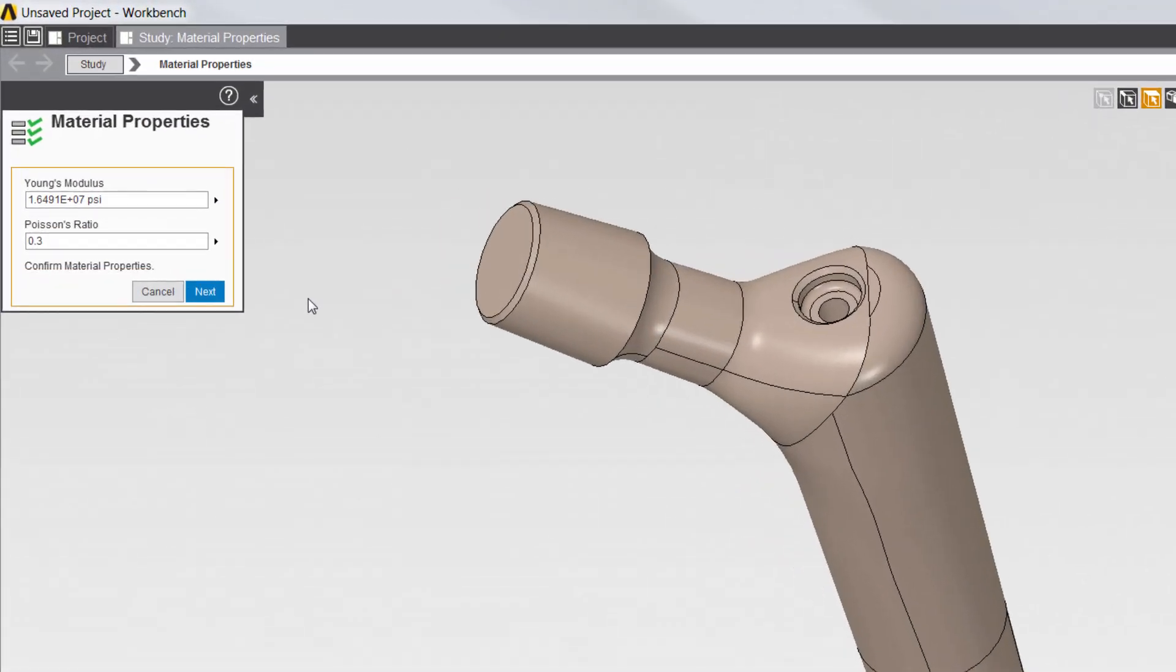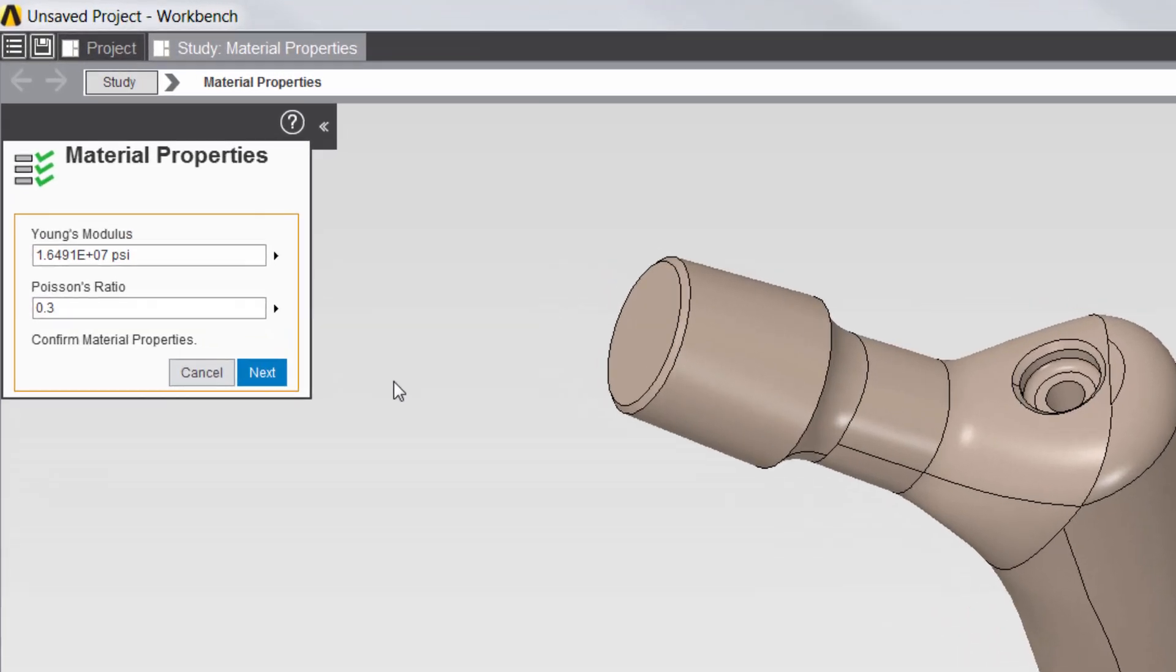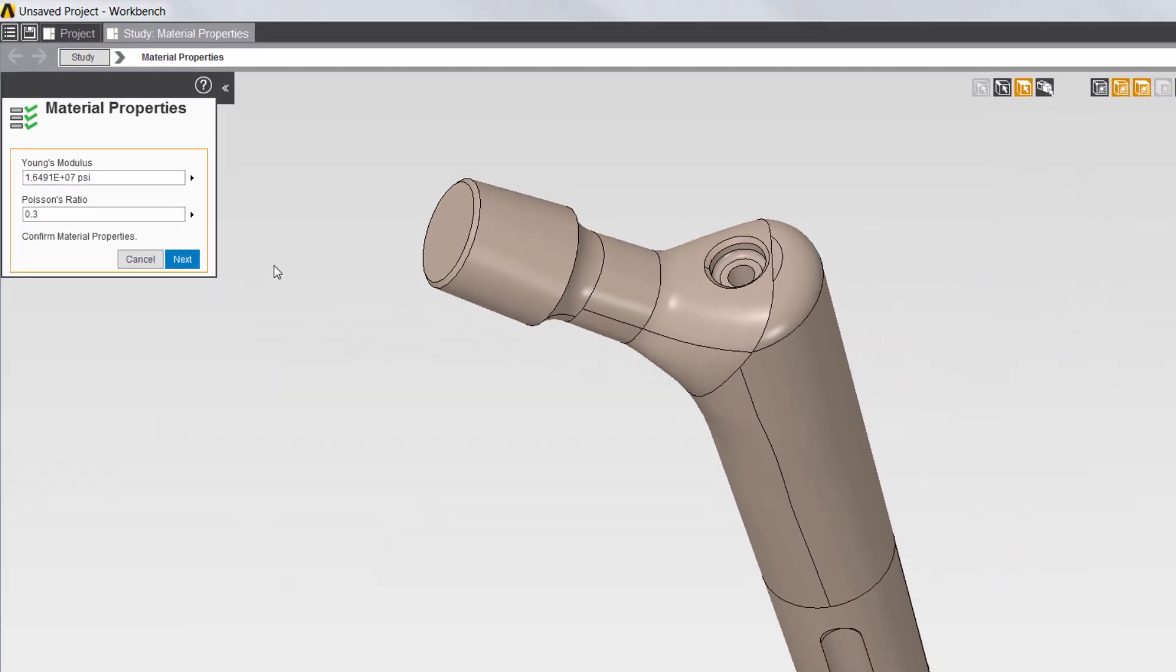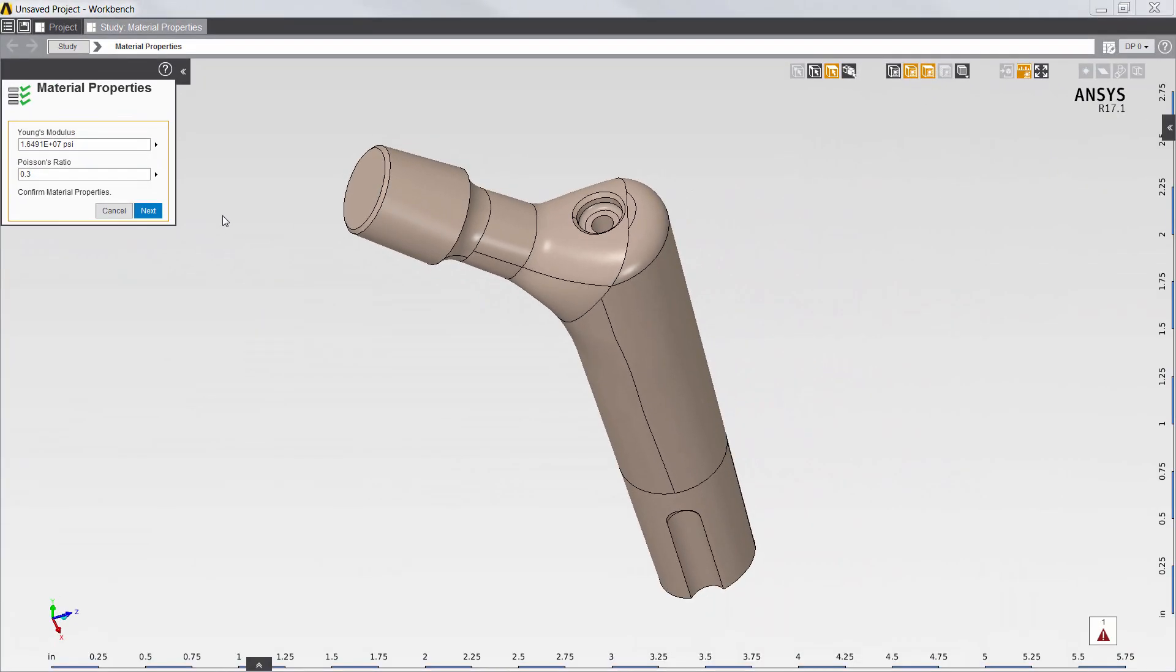Next, I'll define Young's modulus and Poisson's ratio of the implant material. Note that the app has already supplied default material properties based on the validation study included in the ASTM standard.